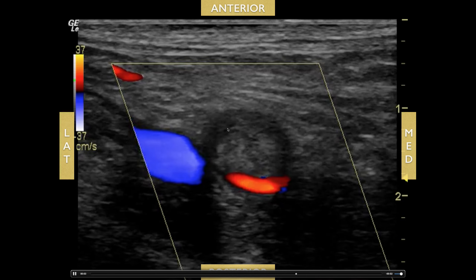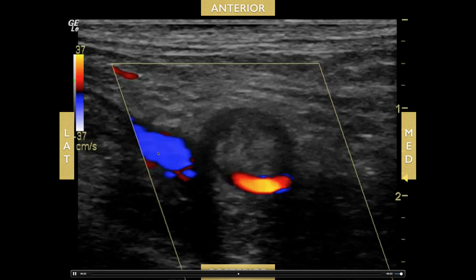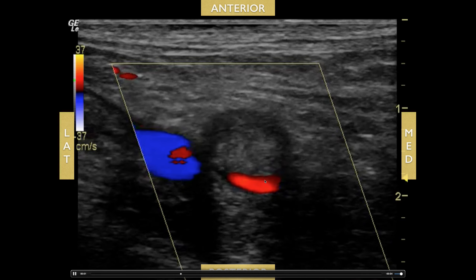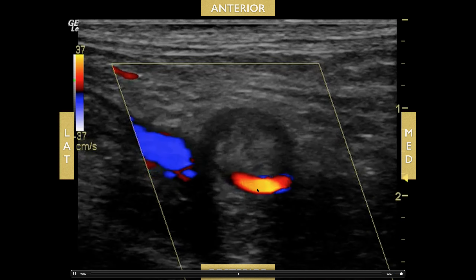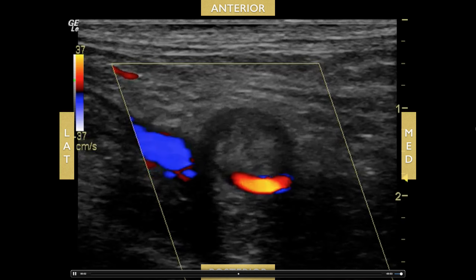Here's another example with color flow. You see the vein here and the artery, with a large clot in the vein. Color flow is applied to see if there's complete occlusion or not — it's not complete occlusion, but it's almost completely occluded. You can see a little bit of flow going in the posterior portion of the vein.